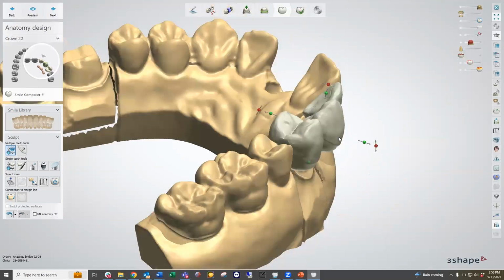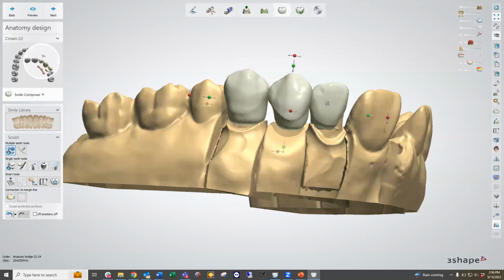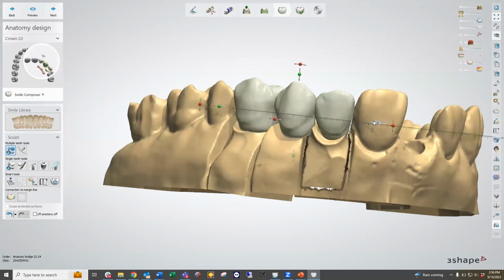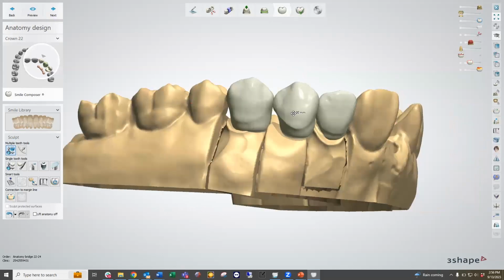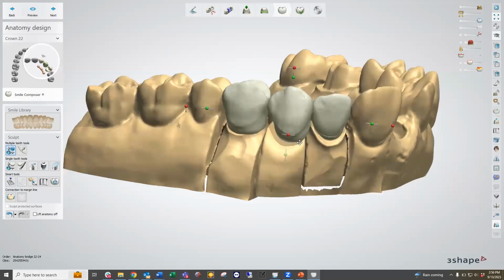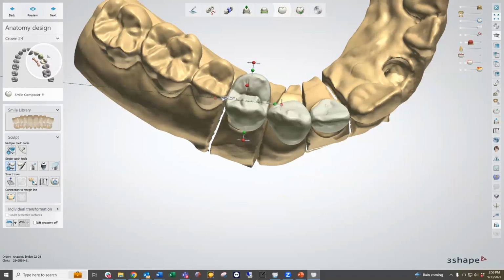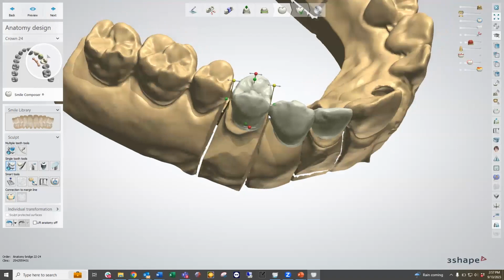And I use my big changes first, which is going to be the multiple teeth change. It allows us to keep the 3 units in their current setup and make the adjustments necessary. So I'm going to bring this out. Maybe I actually bring this over, make these changes. Okay. I feel like this premolar might be a little bit big, so I'm going to change this premolar real quick. If I hold the control key, it allows me to shrink the size uniformly. So rather than just dragging in that side, which makes it skinnier, I can bring the control key in. It allows me to size up and size down that individual piece there.